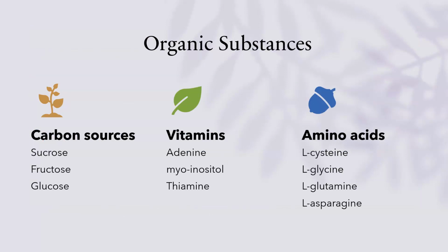Organic substances are compounds containing carbon, such as carbohydrates, proteins, hormones, enzymes, and so on. They are not usually provided to plants because plants normally make their own food. However, plants in culture are too small or incomplete to synthesize all the organic chemicals they need. So, organic substances must be added to the tissue culture media to augment the plantlet's atmospheric or self-generated supply.